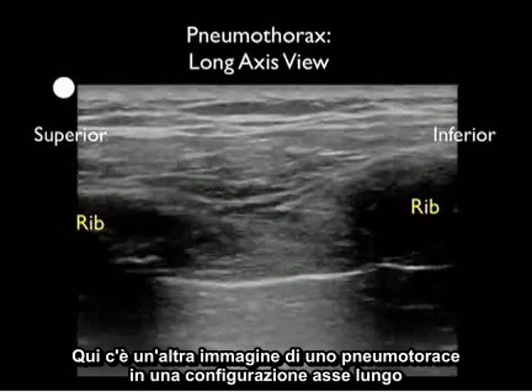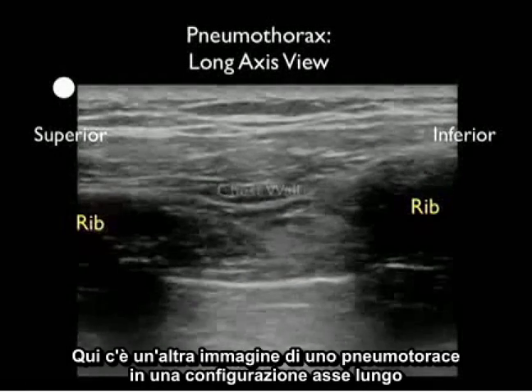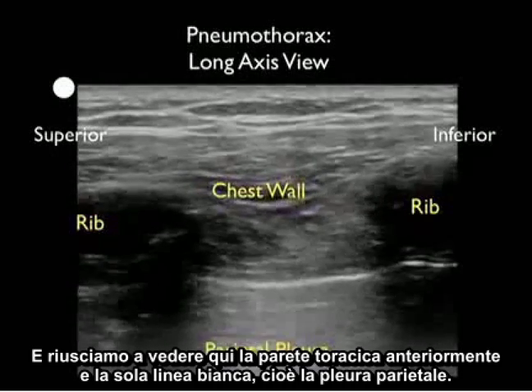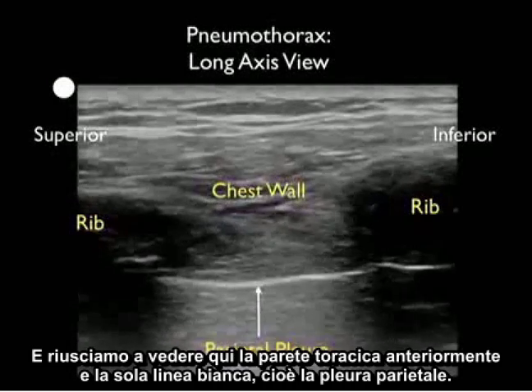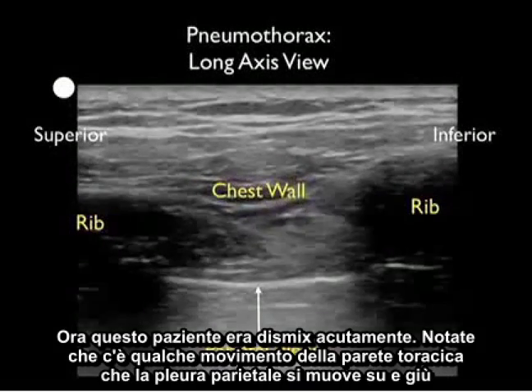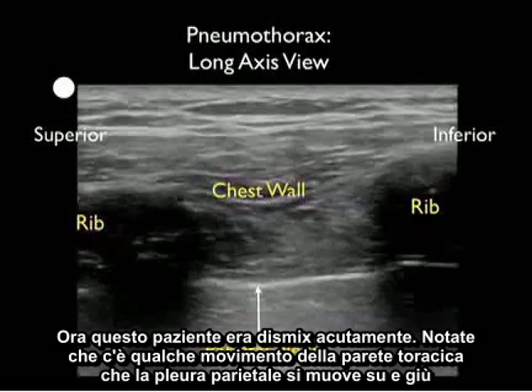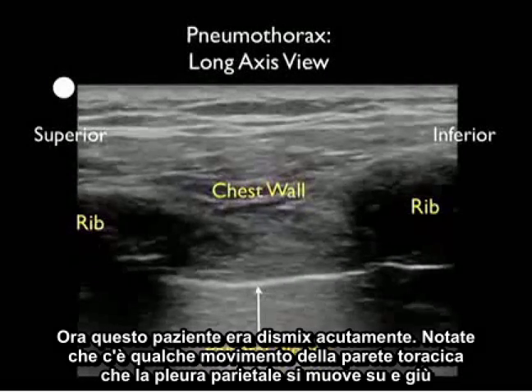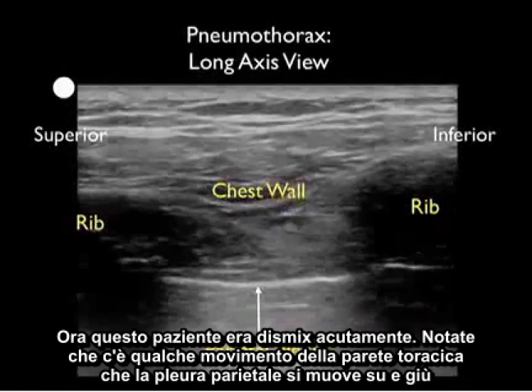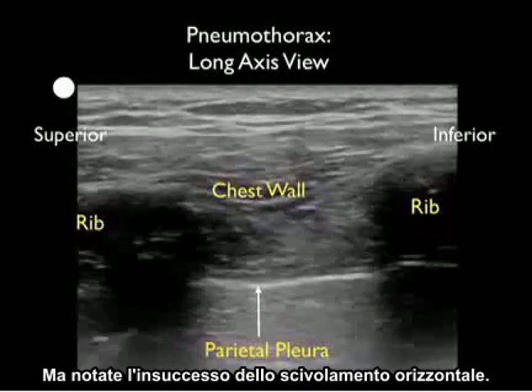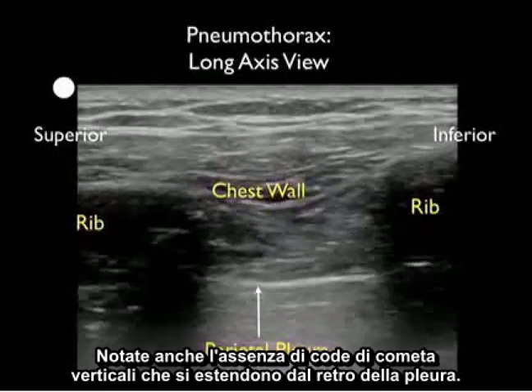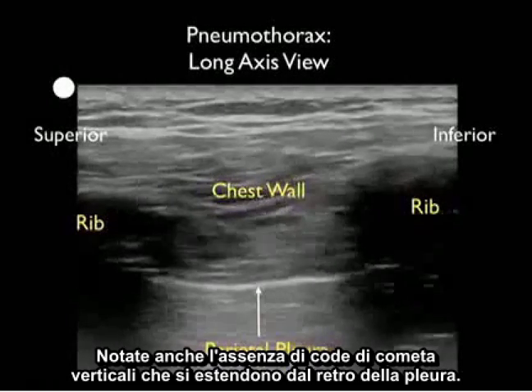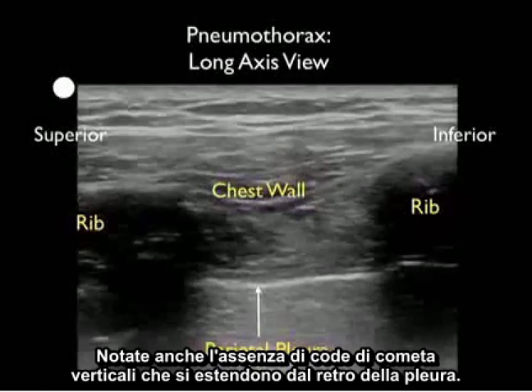Here's another image of a pneumothorax in a long axis configuration. We see the chest wall anteriorly and the single white line which is the parietal pleura. This patient was acutely dyspneic, so notice that there is some motion of the chest wall and the parietal pleura moves up and down, but notice the failure of horizontal sliding. Notice also the absence of any vertical comet tails coming off the back of the pleura.